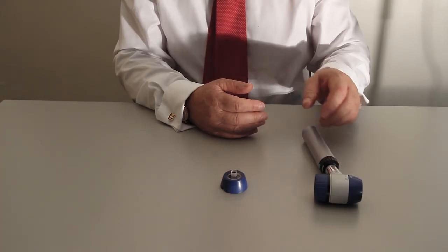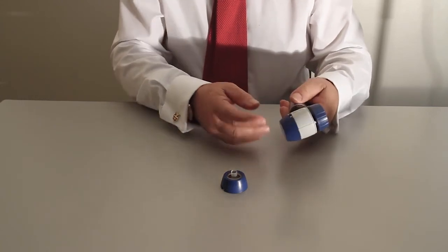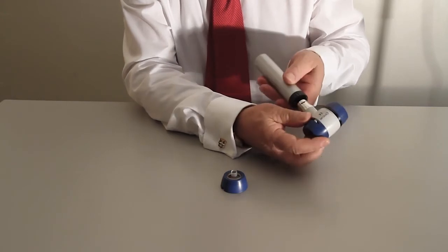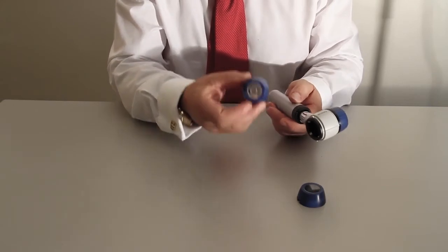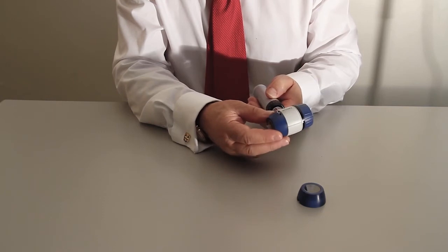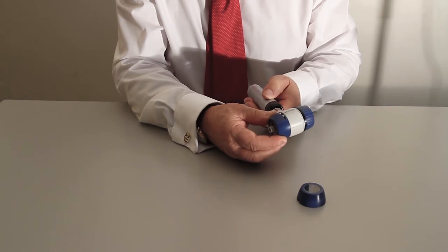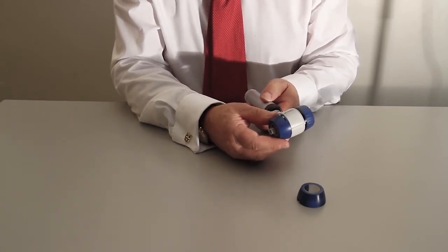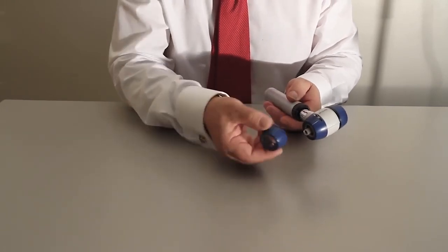Here are a couple of useful accessories for the Opticlar. First of all, you can remove the lens cover here, just slip it off by just moving it to there, put it there. And this is what I call the nipple attachment, really useful for getting into rather inaccessible areas, like for example behind the ear, between the fingers, and also, for example, by the side of the nose, so near the eye. So the difficult areas where you can't get the full lens pushing against the lesion.